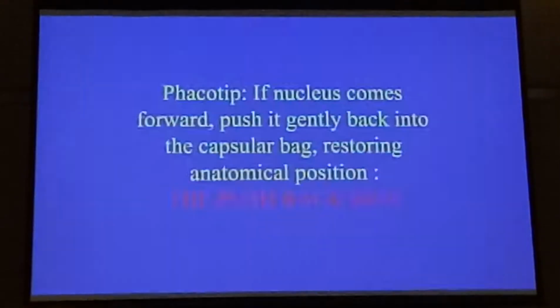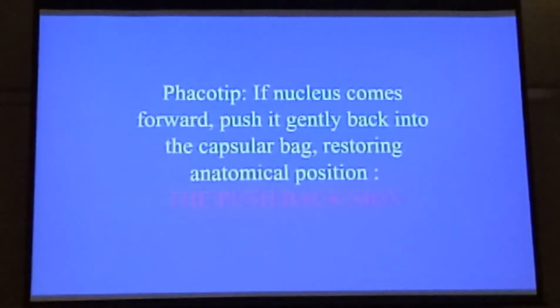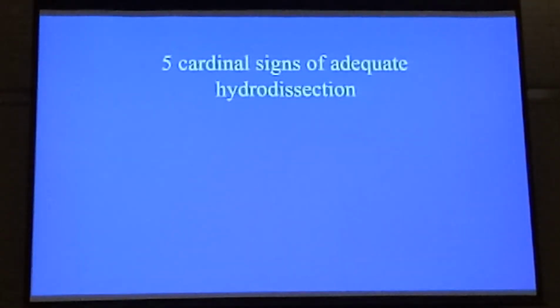Okay? So, now another point is to prove that it's come forward, you push the nucleus back into the capsular bag, and you will see, like in the first clip I showed you, the nucleus actually pops back in. Boom. It goes back in. That's what I call the push-back sign. That also tells you you've got fluid behind the nucleus. So these are the 5 cardinal, very useful signs I will tell you.